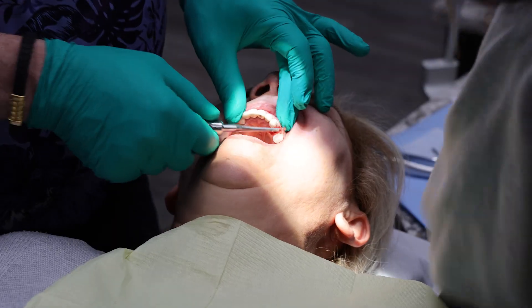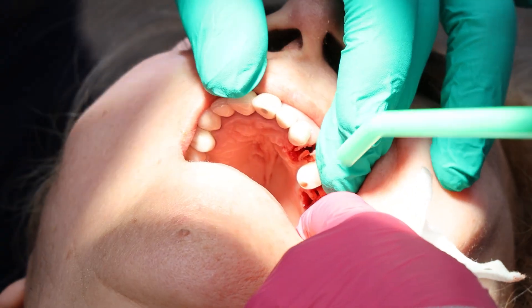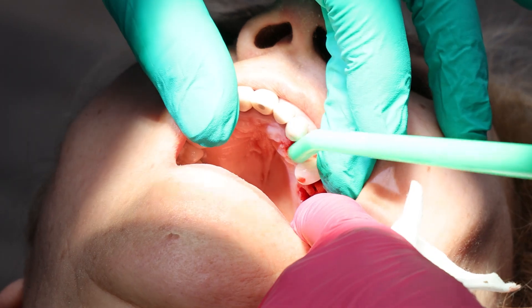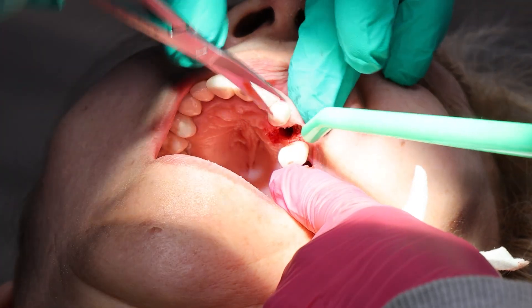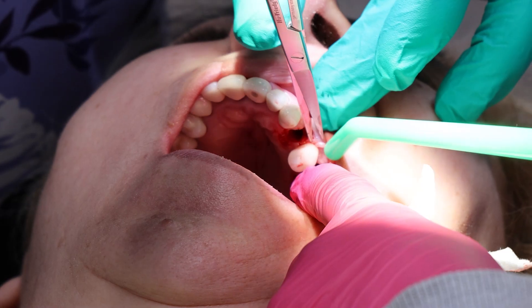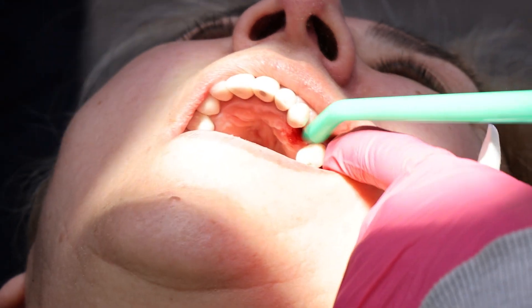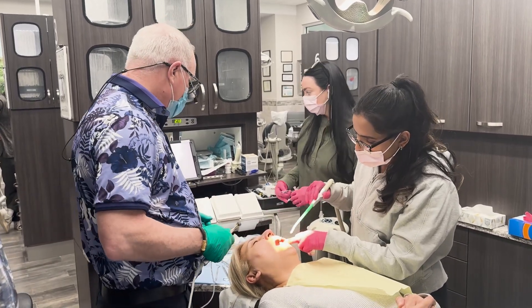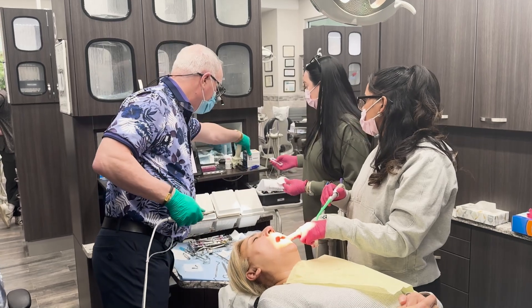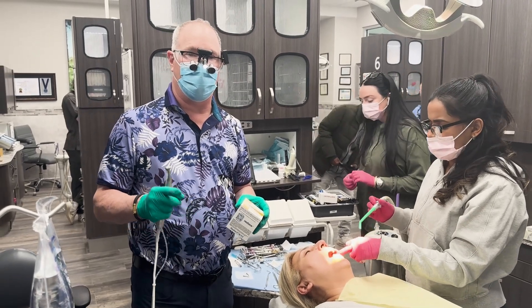Both teeth are out. We're going to do the implants now. So we extracted number 12 and 14 root tips. And we're going to be placing three mini implants: two at number 14, one at number 12.